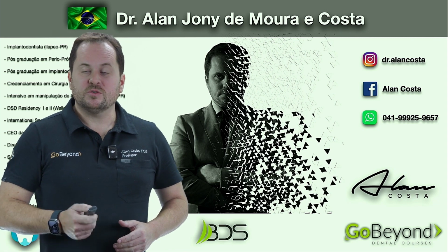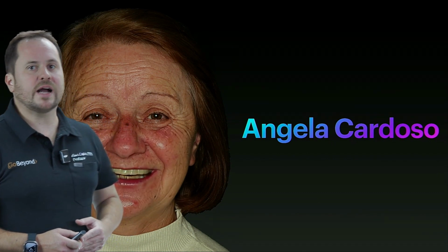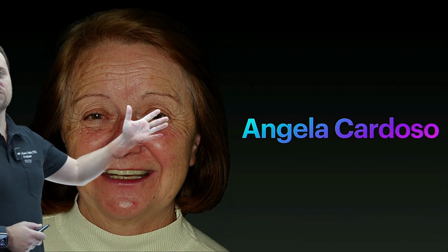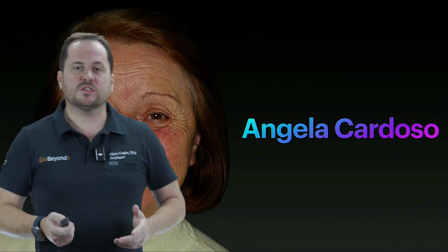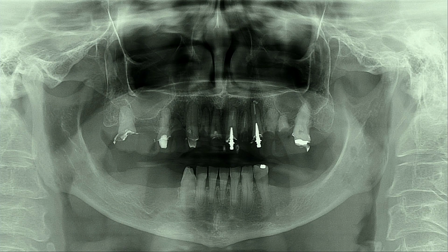Okay, let's go straight to our clinical case. I will show you the case of the patient Angela Cardoso, and I will show you that this is a very common routine that appears in our office. The patient came in this manner at our office.